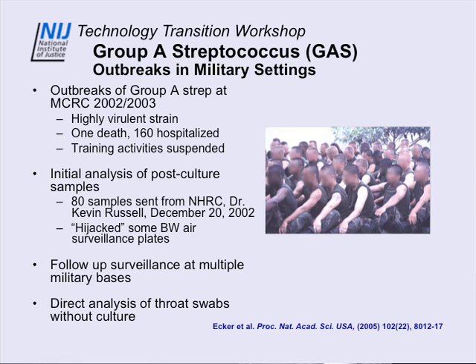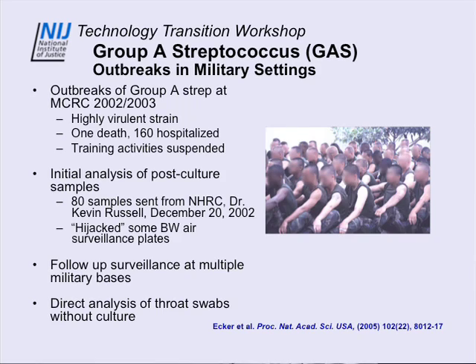We were sent some samples from Commander Kevin Russell right around Christmas of 2002. We had been running some bioweapon surveillance plates that cover a broad swath of bacteria. So we hijacked some of these plates and looked at some of these clinical specimens. We did some follow-up surveillance at multiple military bases. And importantly, we did some direct analysis of throat swabs without culture.